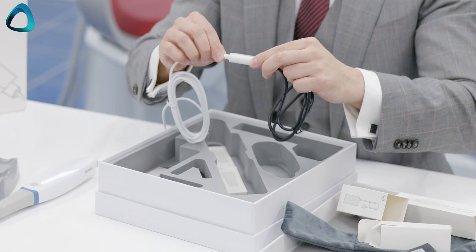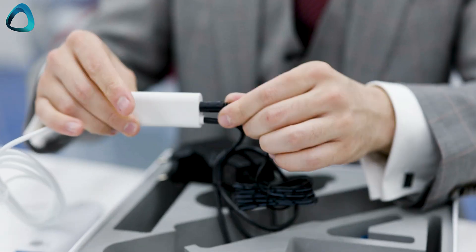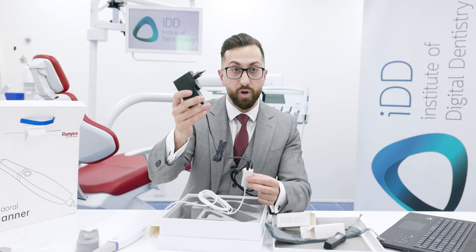You connect the scanner itself to this adapter, and then the wall charger is connected here — so this goes to the wall, this goes to your laptop, and then you can use the scanner itself.